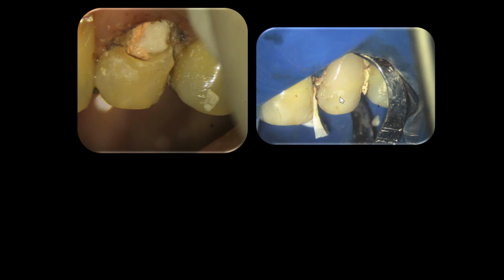Now, why am I showing this isolation? Basically to focus on how effectively I can perform retraction of the soft tissues in class 5 cases if I'm using a Brinker's B4. Also, you can note that when Teflon is packed in between a B4 and the rubber dam, it is very effective in preventing laceration of the rubber dam or any kind of damage to the rubber dam, which could lead to loss of moisture control and loss of stability of isolation.